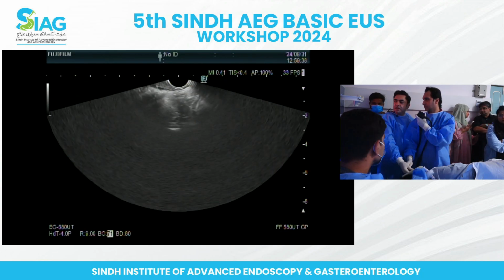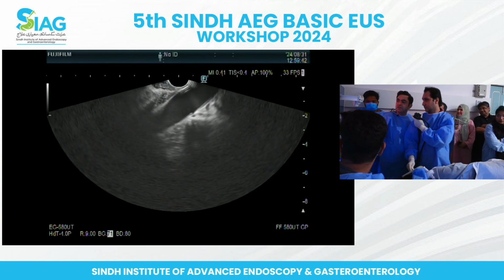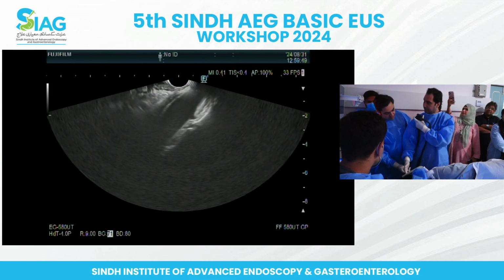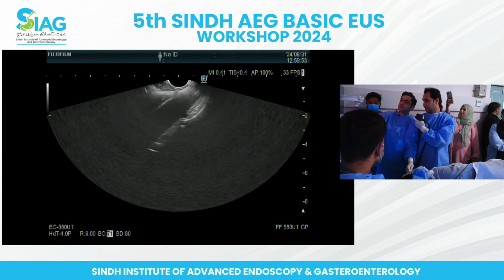I think you're slightly out. You just need to push. There you are. You're coming into position. Can you see that? So that's where the aorta is coming down. So that's your home signal. So are you comfortable with your hand? Just keep it loose. Yeah, excellent. That's great. Okay, so now just move it left and right a bit.